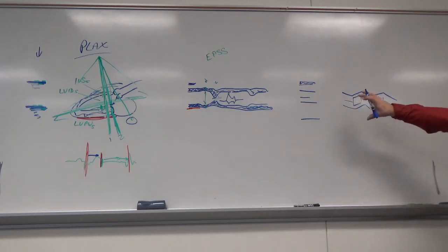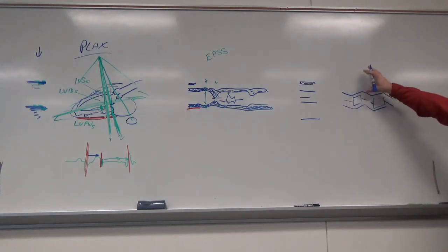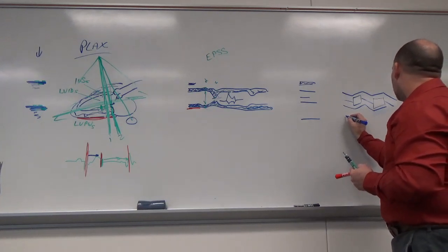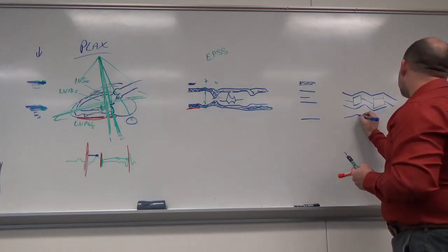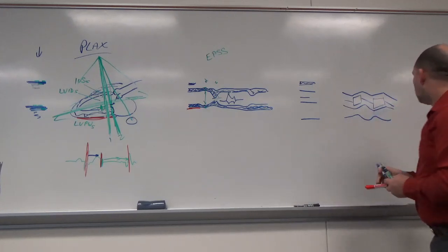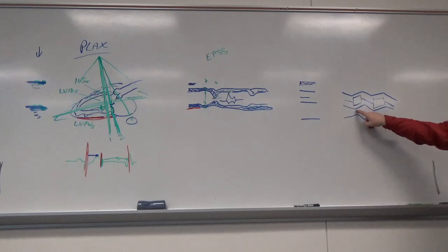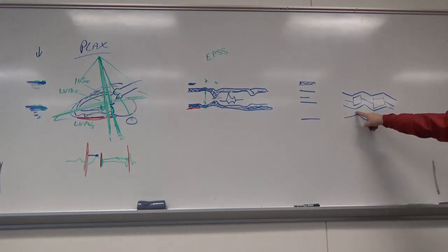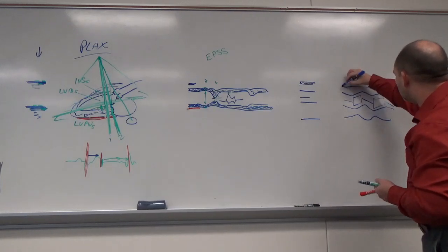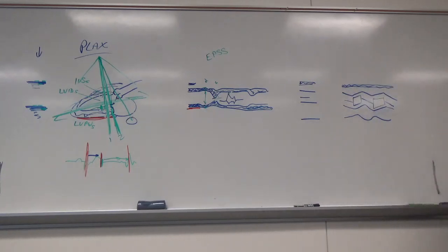You see that the aortic root, as the heart beats, is going up and down with the motion because of all the contractions going on. It's being pulled in those different ways. And then we've got the atria, which goes opposite of these. So the timing of these is going to be important. On top here, we've got the right ventricle that you'll see all along the top. So that's what we're going to see on the M mode through these valve levels.